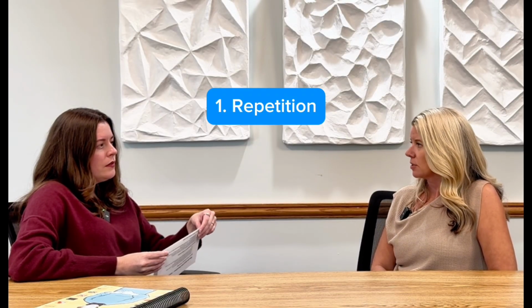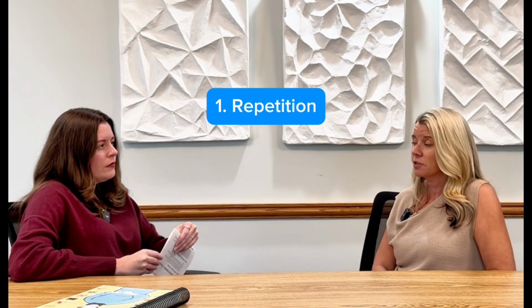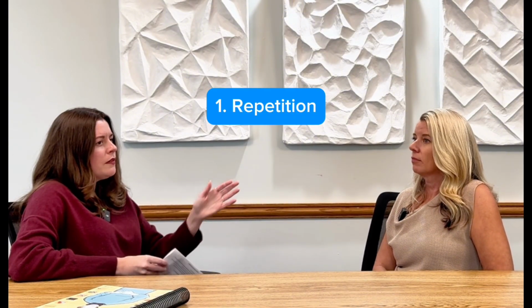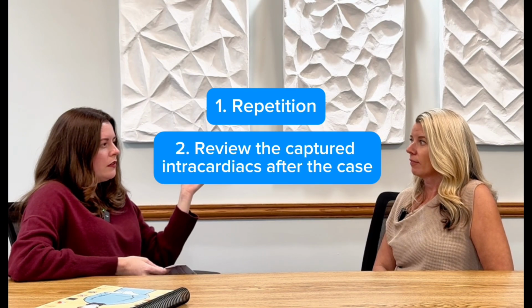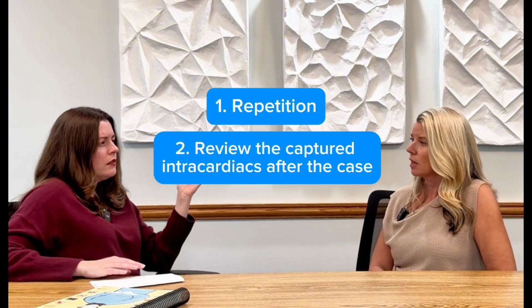You have to do the case. You have to see the intracardiacs. You have to watch the pacing protocols. You have to watch the screen. It has a full disclosure. You can go back and replay, right? The recording? Yeah. If they're recording, which they should be recording anytime they're pacing, yeah, you can go back.